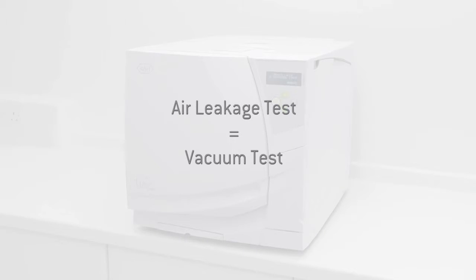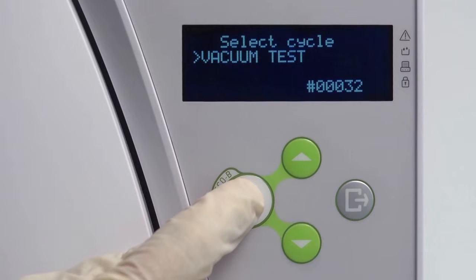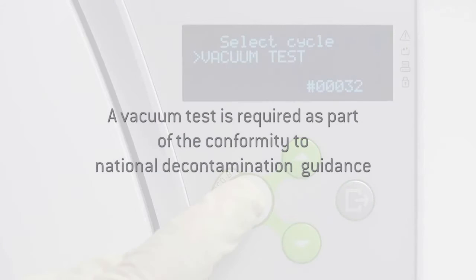The Lina NB version of the air leakage test is termed a vacuum test and can be found within the test cycle's submenu. A vacuum test is required as part of conformity to national decontamination guidance. It tests the integrity of the Lina steriliser's closed pneumatic circuit.